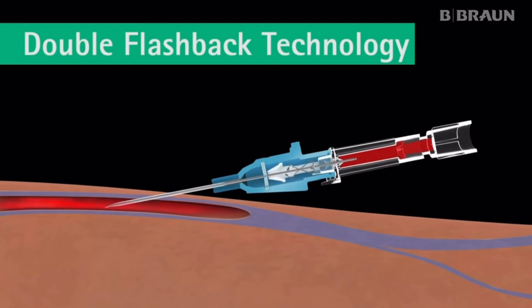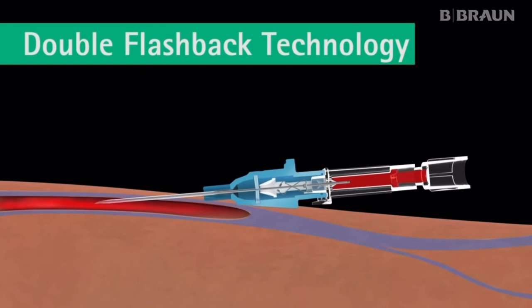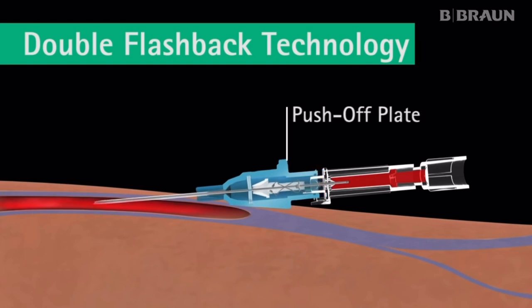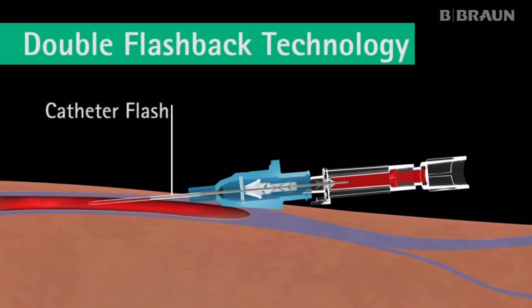Then the entire device, catheter and needle, is lowered and advanced slightly into the vein. Using the push-off plate on the catheter hub, the catheter is advanced forward, off the needle, into the vein. A second flashback, catheter flash, occurs between the catheter and the needle, confirming that the catheter is successfully in the vein.